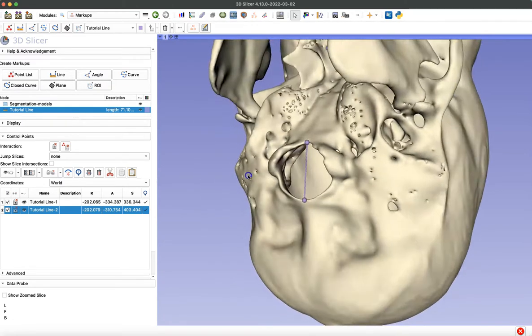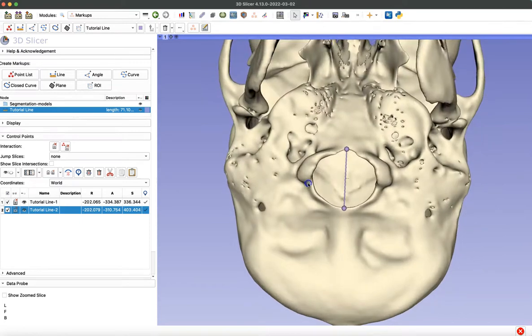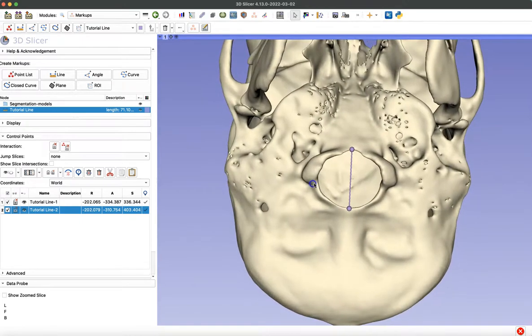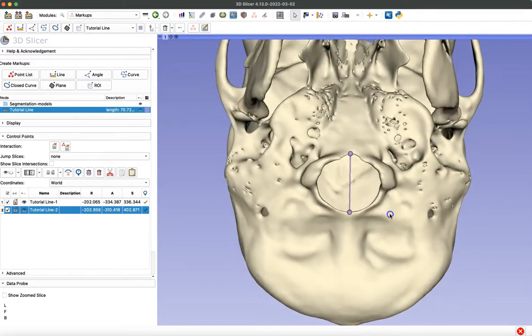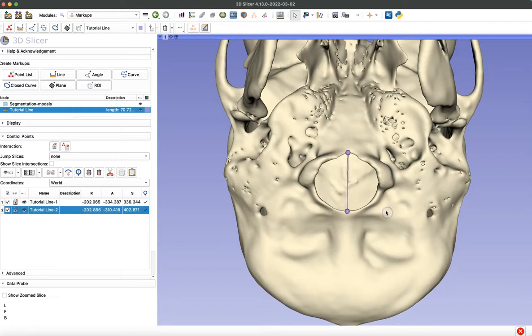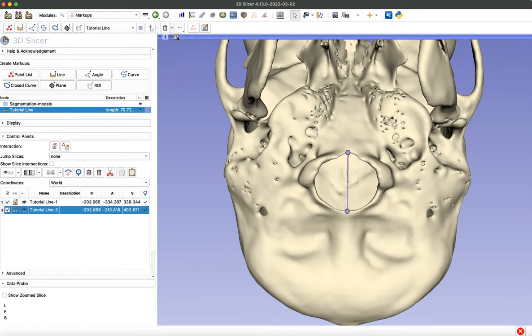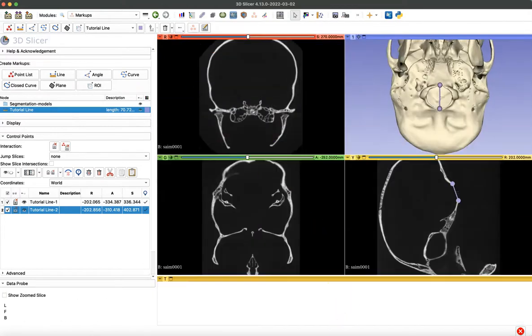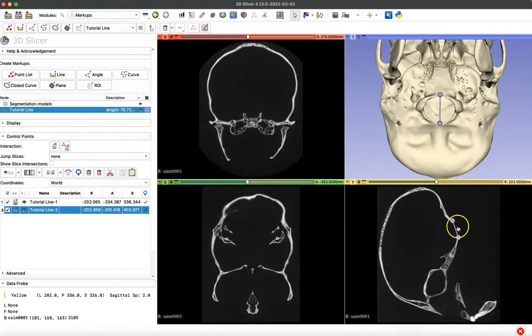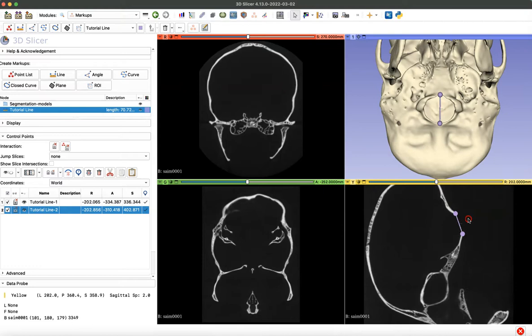You want to move your model back and forth to check your placement of those points. And you can adjust them even after you place them by just clicking and dragging. But another thing you can do is click this icon to jump back to that three slice perspective.